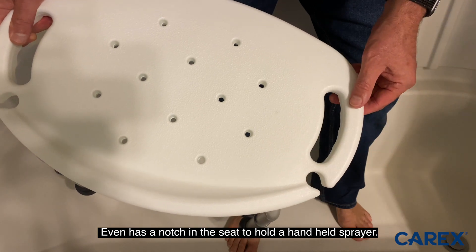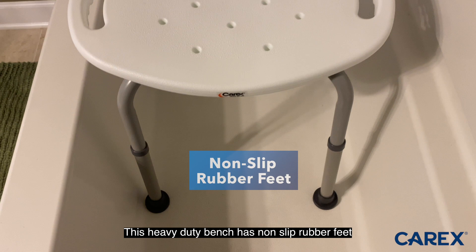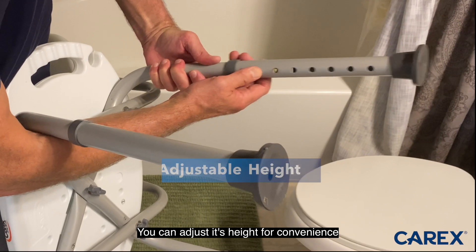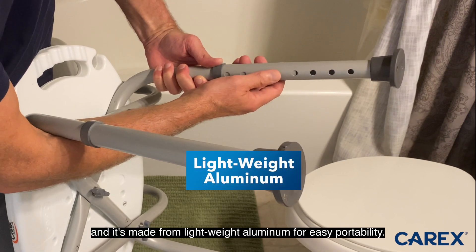It even has a notch in the seat to hold a handheld sprayer. This heavy-duty bench has non-slip rubber feet guaranteeing a firm grip that won't move or slip. You can adjust its height for convenience and it's made from lightweight aluminum for easy portability.